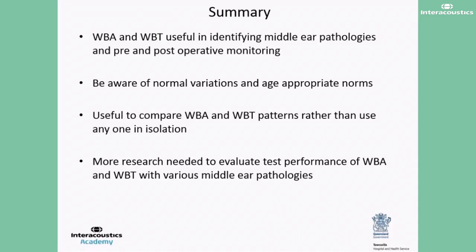We do have a question here. One of the questions is, I would like to ask you a question about your experience with PE tubes. Have you seen cases where the PE tube seems to be working well while the absorbance measure shows a middle ear problem after all, like findings like glue?